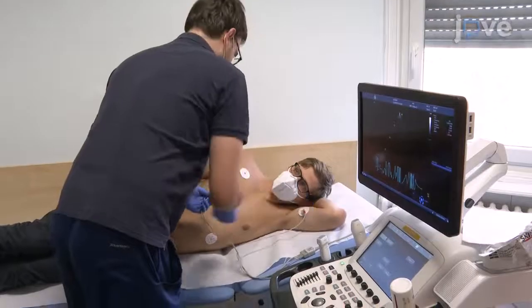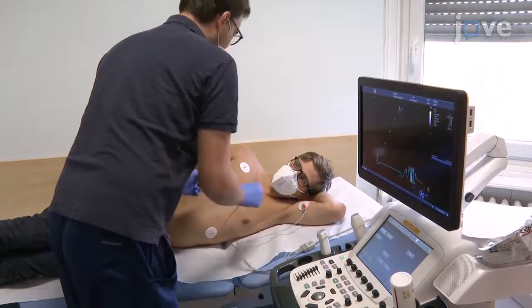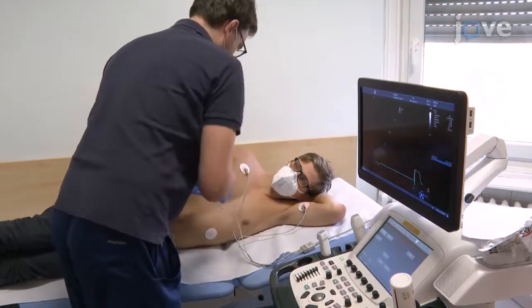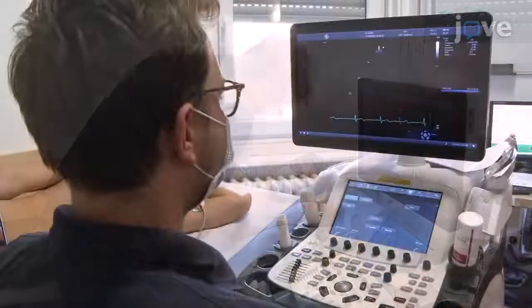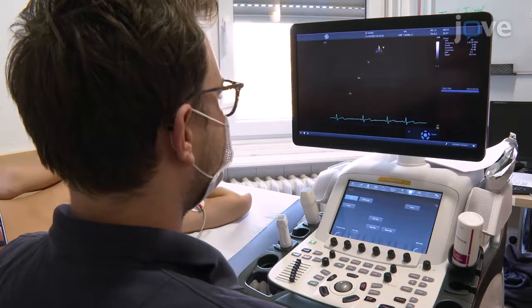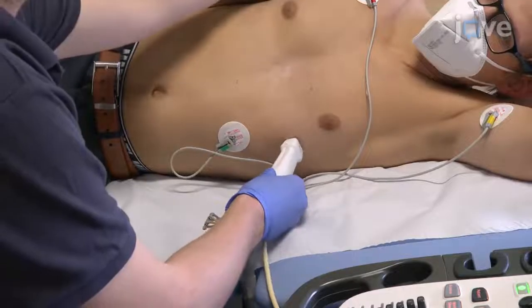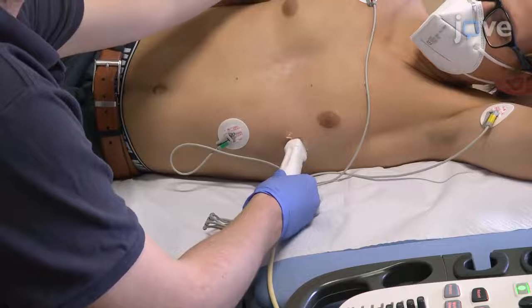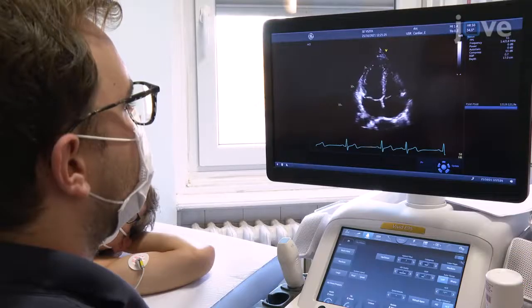For the acquisition of 3D echocardiographic images, position the patient in the left lateral decubitus position and confirm that the ECG tracing on the screen is of good quality. Unfreeze the image and begin to examine the patient with the transducer to visualize a conventional apical four-chamber view.